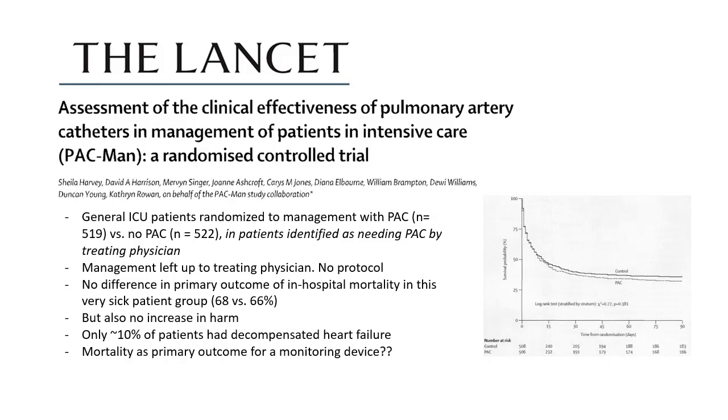So what they found was that there was no major difference in the primary outcome of in-hospital mortality, but also no increase in harm, which was the concern from the early studies. And I thought it was interesting that only 10% had decompensated heart failure. And as we'll mention again on another slide, is it fair to judge a monitoring device by mortality as your primary outcome? So that's the PAC-Man trial.